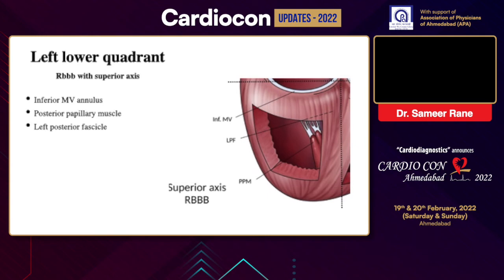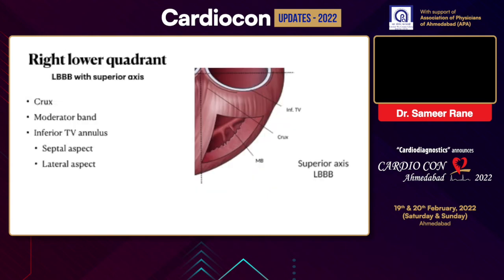The cardiac crux is an epicardial space where all four chambers of the heart are in closest proximity. It's also the junction of the MCV and the CS. PVCs from this area have a left superior axis, an early V2 transition, and features suggestive of an epicardial origin, such as a pseudo delta or a maximal deflection index of more than 0.55.